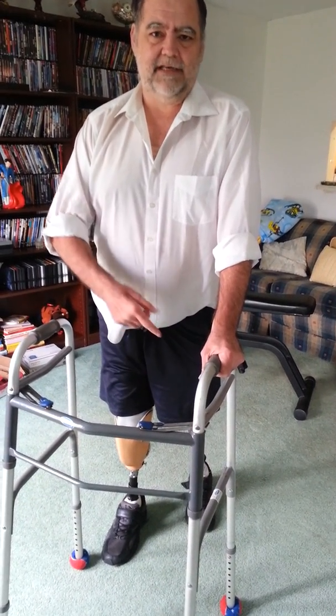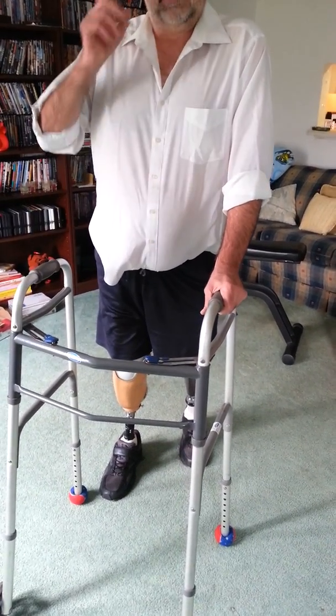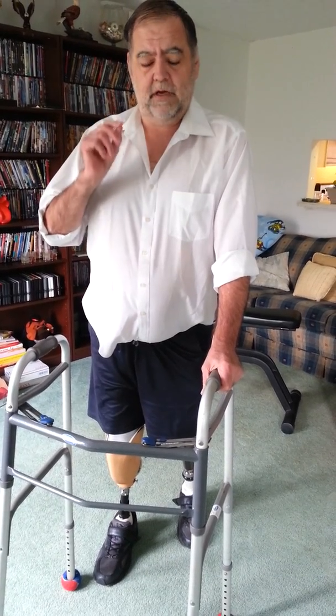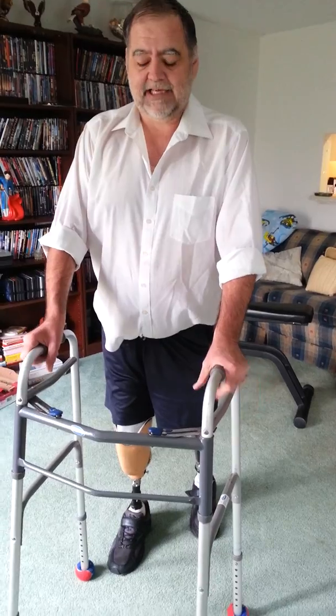Now, I just did lock the knee, but that's because I figured it out. You have to do something that is mentally wrong to be able to lock this knee. In real life, if I still had a leg there, that would be a hyperextension, and it would be very painful. So when I first learned to walk, I had to consciously act like I was hyperextending that knee, which I don't have. It's a mechanical knee. That's, of course, why it doesn't hurt now, but that's what it takes to lock it.